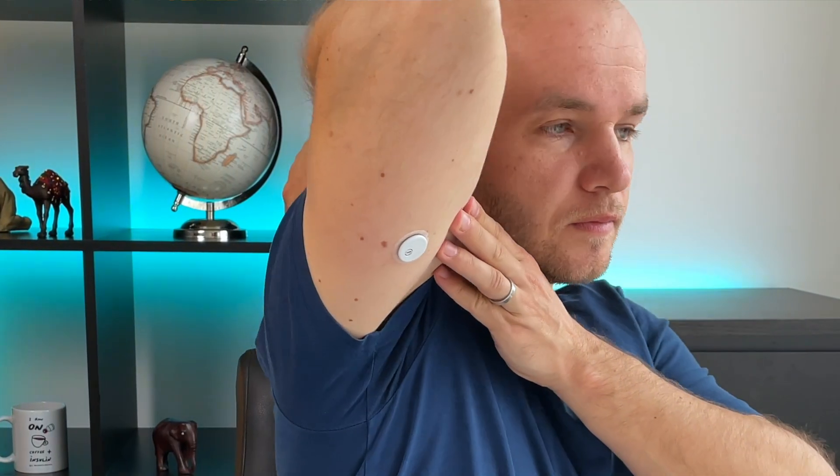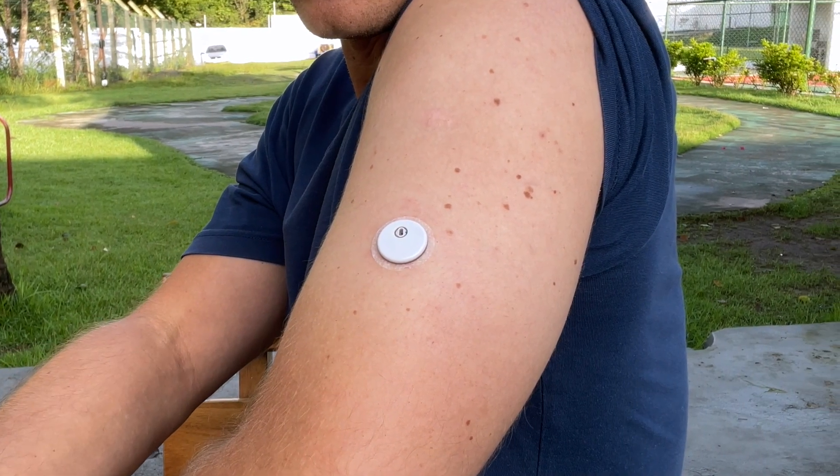By the way, the upper arm is the only spot that is officially approved for Freestyle Libre 3 application. So if you don't want to lose the guarantee, don't place it anywhere else.